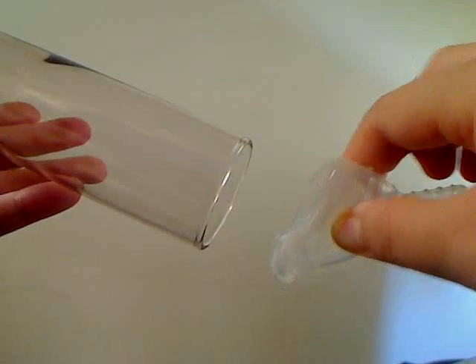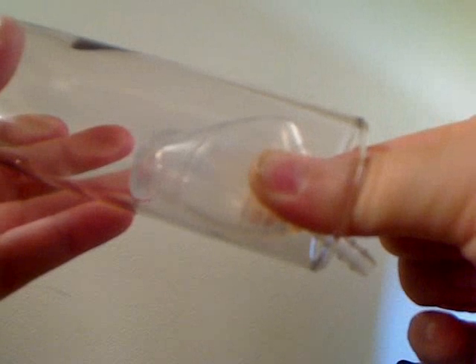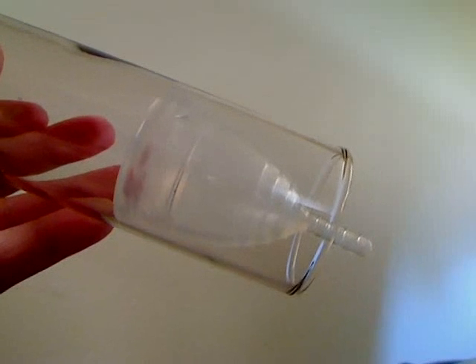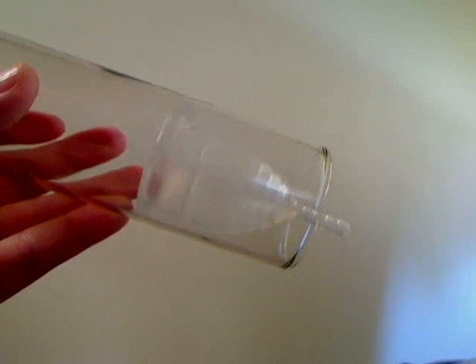So to insert it, you fold it the way I demonstrated, and you insert it inside the vagina, again angling back, and then you let go of it. It will naturally open on its own, then it forms a seal up inside of you, and it catches all the menstrual fluid, or the blood, if you will.